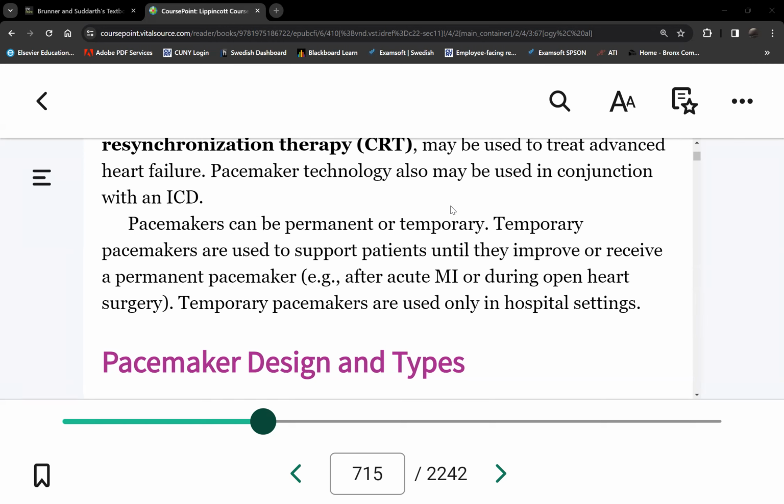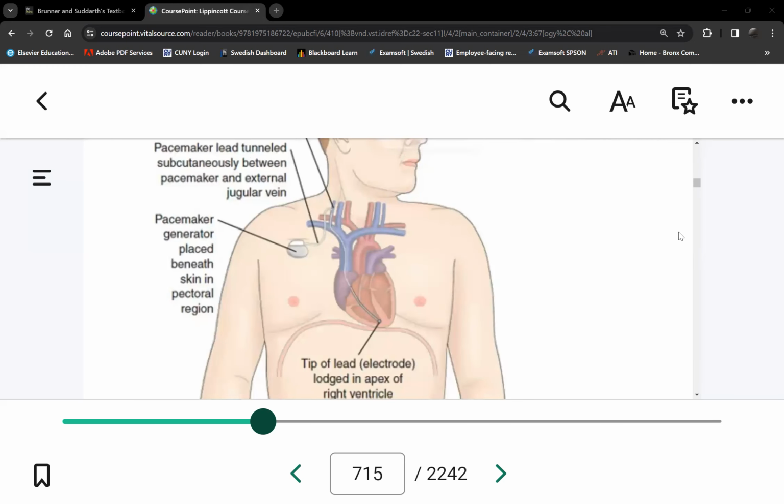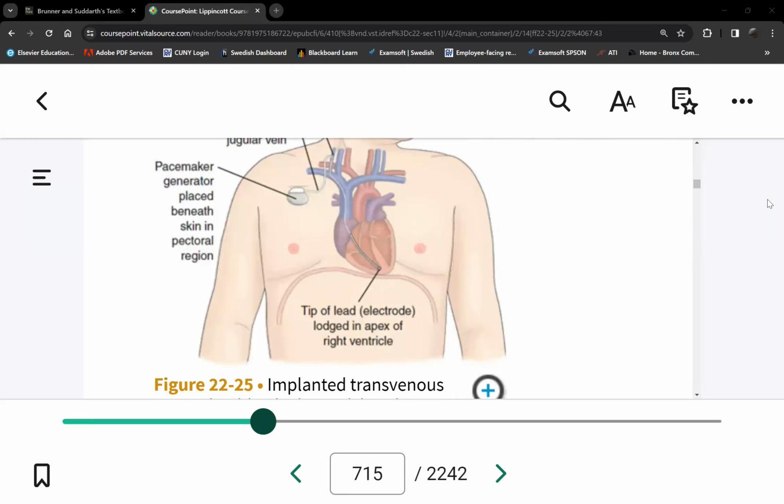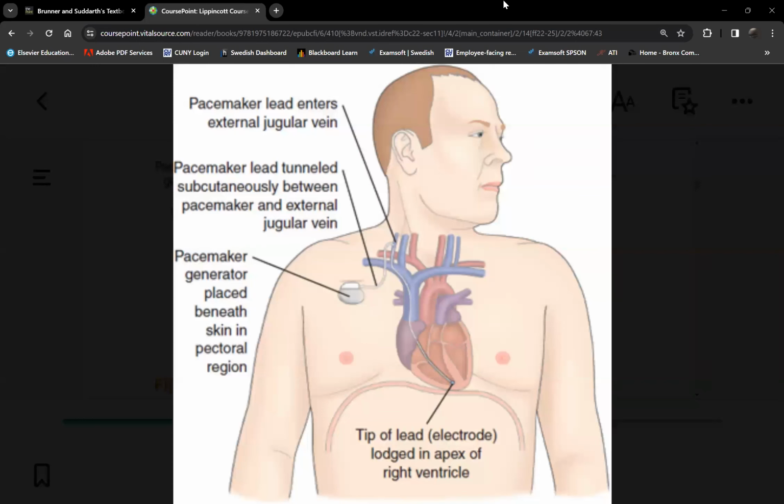We call it transvenous. Now, that type, let me show you the picture. This is not this, because this is now the permanent pacemaker. So in a permanent pacemaker, this is the pacemaker inside the patient's body underneath the skin, and then the wires are threaded into the heart, into the atria and the ventricles. Now, in a transvenous, that pacemaker remains outside. Bigger though, not as small as that. It's a bigger device. However, the wires are inside.